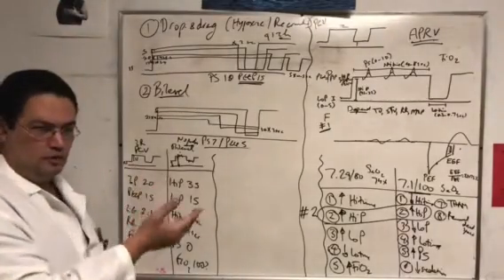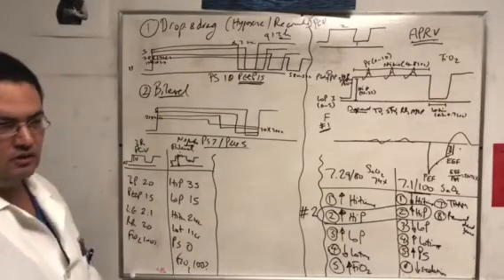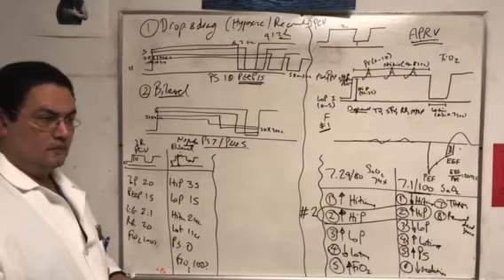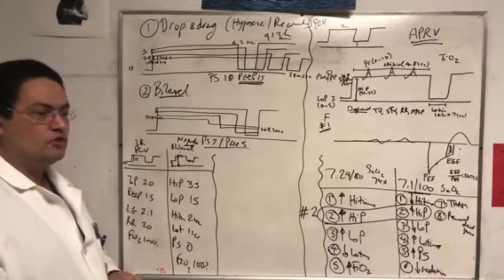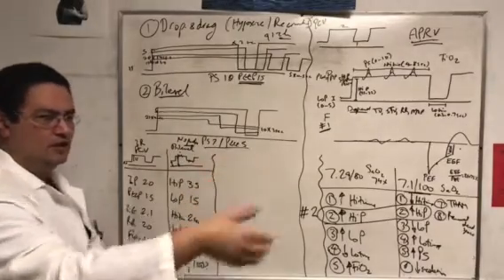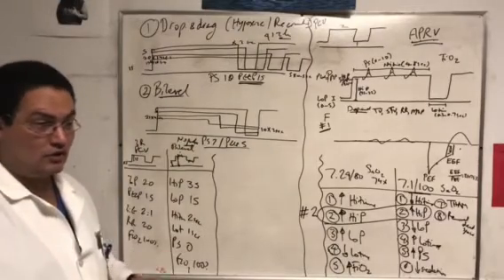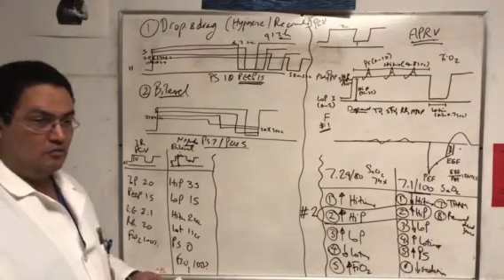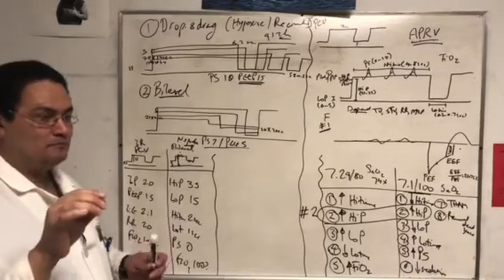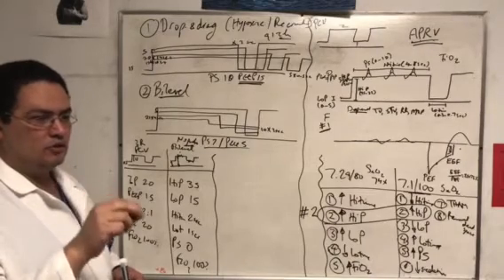We do pressure control for paralyzed patients and ARDS, and we do pressure support obviously for patients who are getting extubated, but most of the other modes are gone. So we switched for all the advantages that I've told you, and all the claims to fame, the 8 claims to fame that I've said through the whole lecture, and the sedation, and all of these things, right? But the last straw that broke the camel's back was something that we noticed, which is another claim to fame, something that we noticed on pressure control.